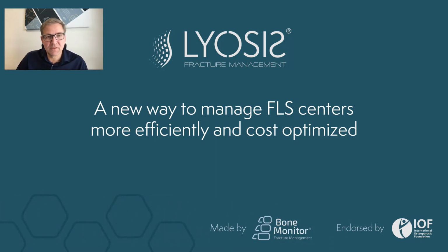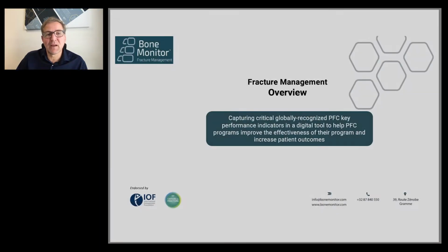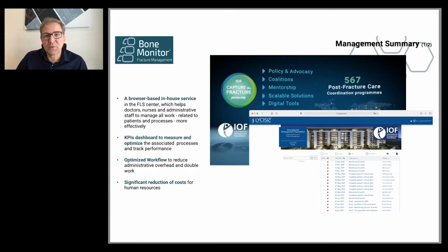It's a pleasure to introduce you and give you a live demo of our Lyosis software, which makes fracture management easier. In principle, the Lyosis software is part of the CTF program. It's one of the 5 pillars in the CTF program: the policy, the coalition, the mentorship, and the scalable solutions, and Lyosis is the 5th pillar, which is called the digital tool.